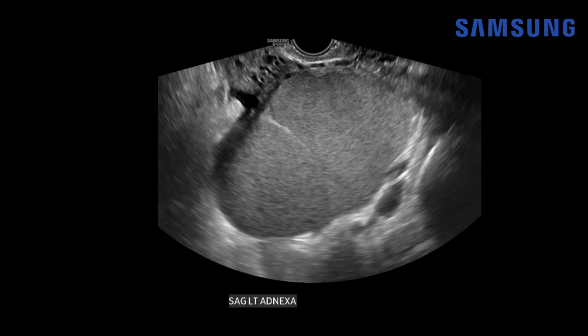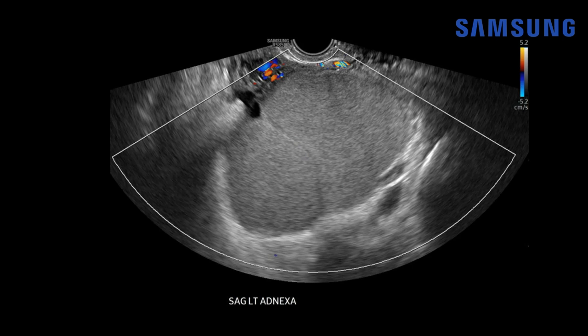Let's start with case one. This was a patient that presented for follow-up of an adnexal mass. Here we have a large mass in the left adnexa arising from the left ovary. You can see that it has homogeneous low-level echoes diffusely throughout it. There's also some posterior acoustic enhancement and we see a thin septation giving the mass a bilobed appearance.